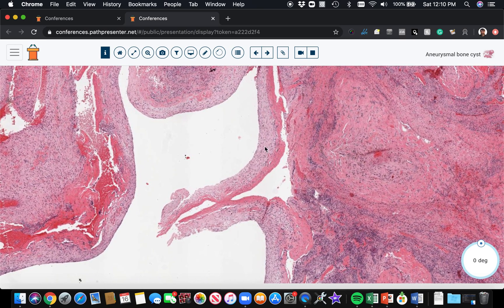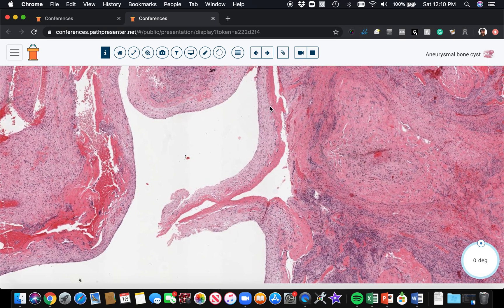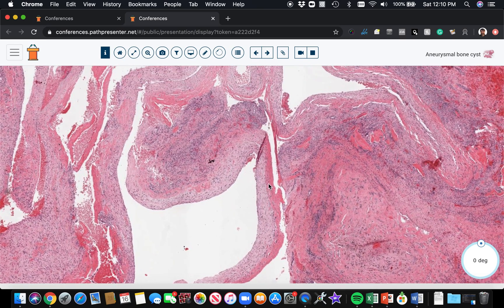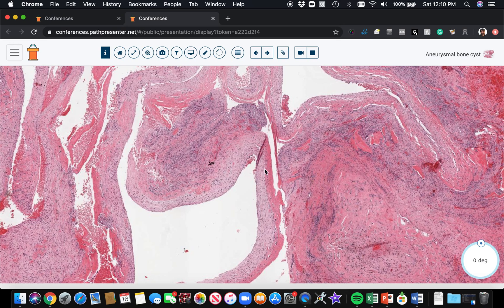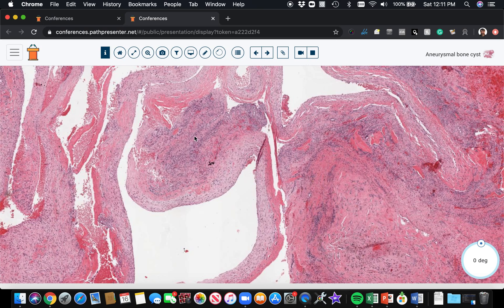And in the septa you've got the fibrous tissue and also the dense osteoid sometimes being laid down. And it's kind of a, you know, it can really run a range from really nice well-formed bone down to just kind of dense sclerotic collagen, and it kind of can be everything in between.